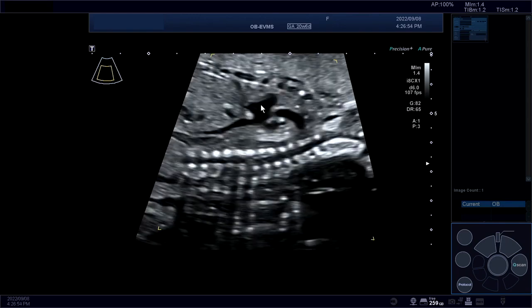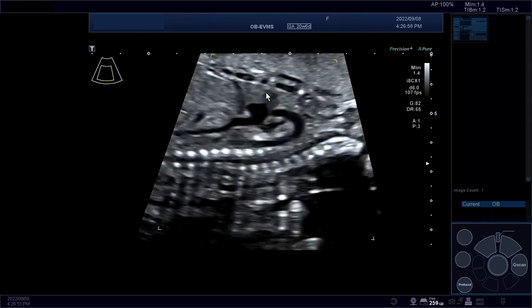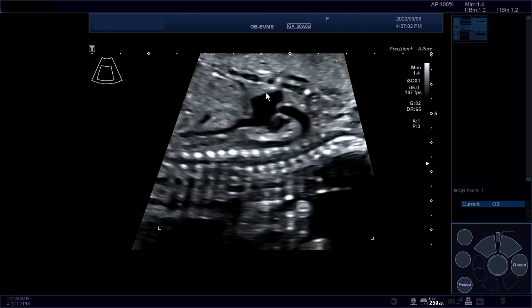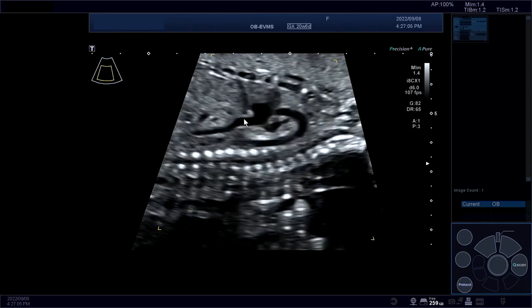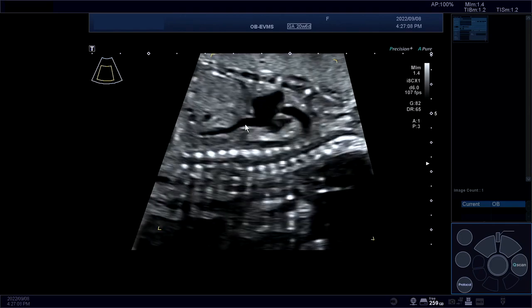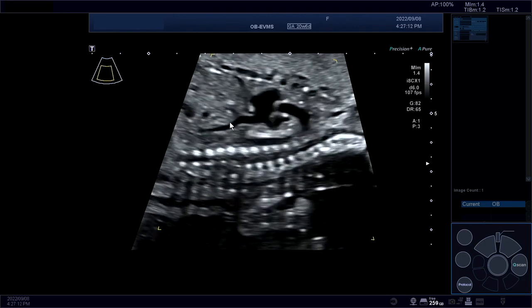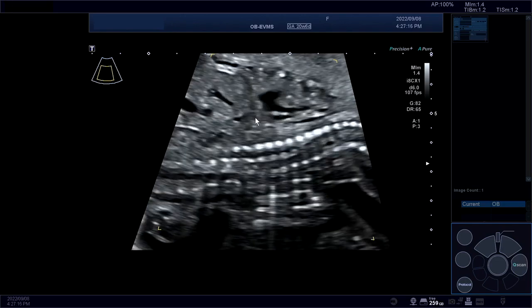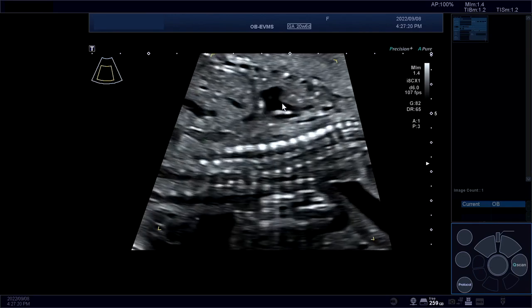Here you have the right atrium. Look at the right atrial appendage. This is a great view when you are dealing with heterotaxy and trying to determine which atria is which. This is really an important view because you see this is the right atrium and you see the IVC coming in, and here's the Eustachian valve at the border as the IVC enters the right atrium. You see that clearly. And then in this view, you see the SVC coming from on top, the IVC.